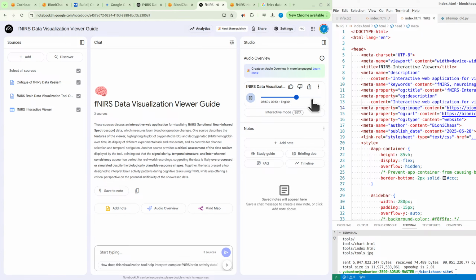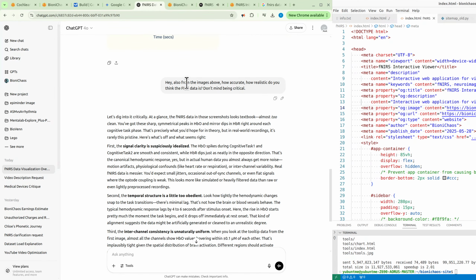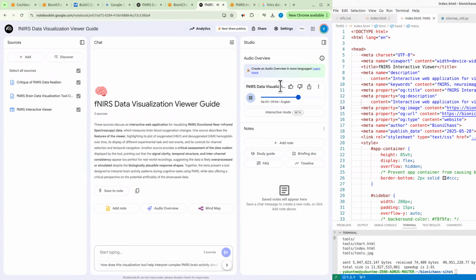Can you change the speed? Real time might be slow. Usually, yes. There's often a drop down for playback speed, 1x, 2x, 0.5x, that kind of thing. Plus, toggles to show only HbO or only HbR. Sometimes isolating one makes patterns clearer. And a reset zoom button? I guess you can zoom in. Oh yeah, essential feature. You can typically zoom with the mouse wheel or pinch gestures and pan by clicking and dragging on the plot itself if you zoom way in and get lost.